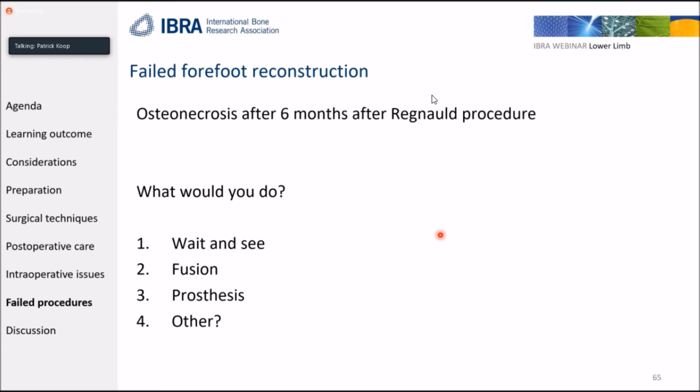Martin, there has been a question by Trevor. Do you consider rotation of the first met? A lot of surgeons in our area are becoming more focused on the rotation of the first met and systems that correct the hallux valgus deformity on all 3 planes. Right. The rotation is definitely something that you have to consider, especially in severe hallux valgus deformities, it's something you have to also address.